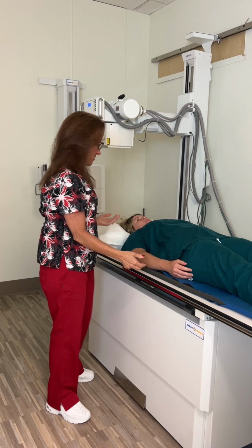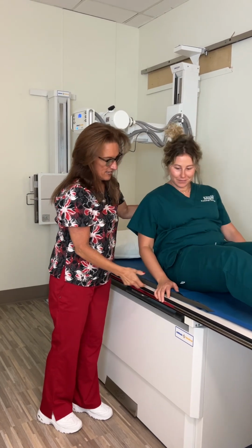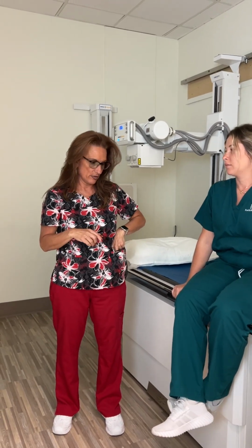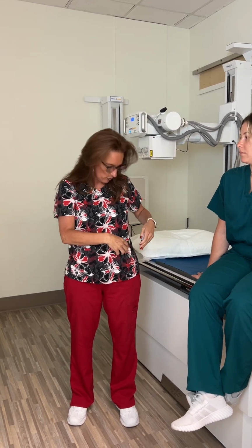I'm going to let my patient sit up. You can sit there for a second. And then if those images came out, I would take her back to the dressing room, let her get changed, tell her that the radiologist would read those and send them to her doctor within 24 to 48 hours, and then I would walk her back out. And that is an AAS on a sthenic patient.